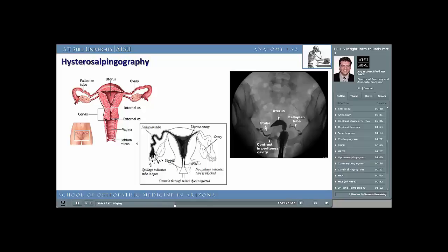The middle image shows us a blocked fallopian tube on the patient's left salpinx. Whether it's blocked from cancer, prior surgery, or a congenital malformation is unclear. It simply tells us the patient only has one properly functioning oviduct.